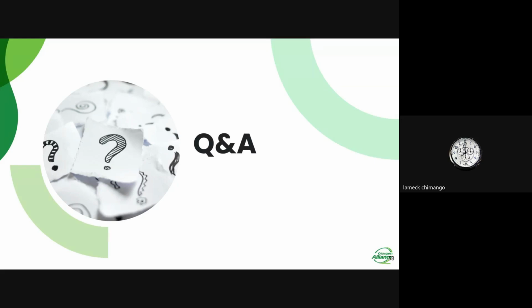Right, thank you so much. It's a powerful presentation. Thank you for the detailed information that you've given. I just have a single question. You talked about the splitter and the humidifier bottles connected after the splitter. I saw that there are also bacteria filters connected to each of the bottles.